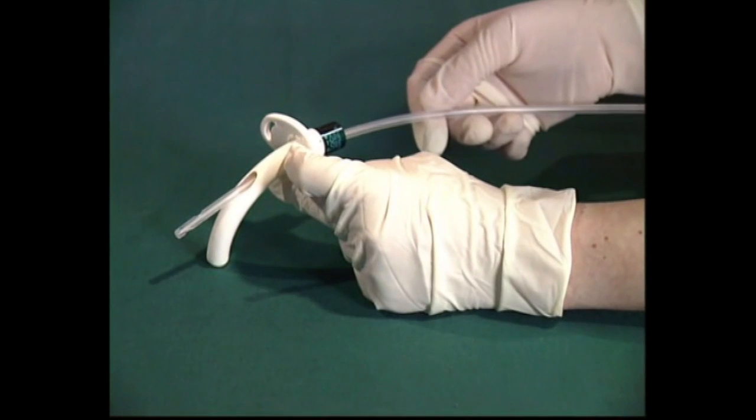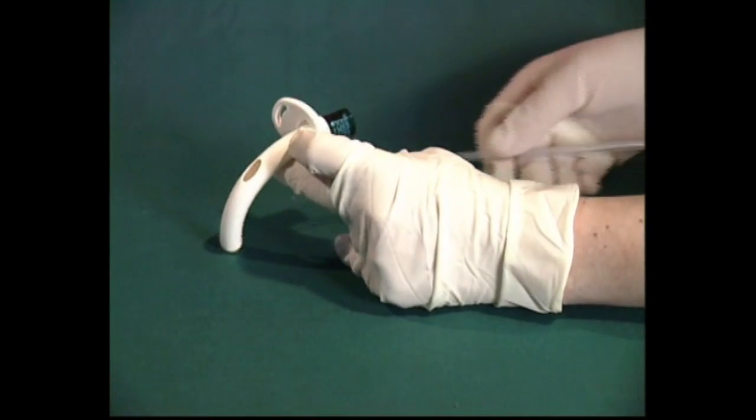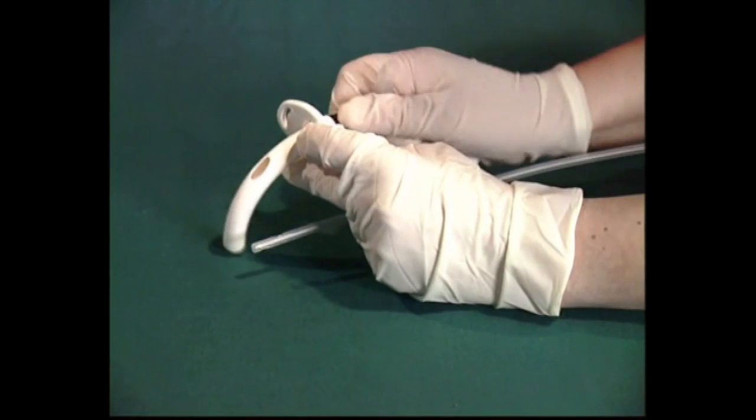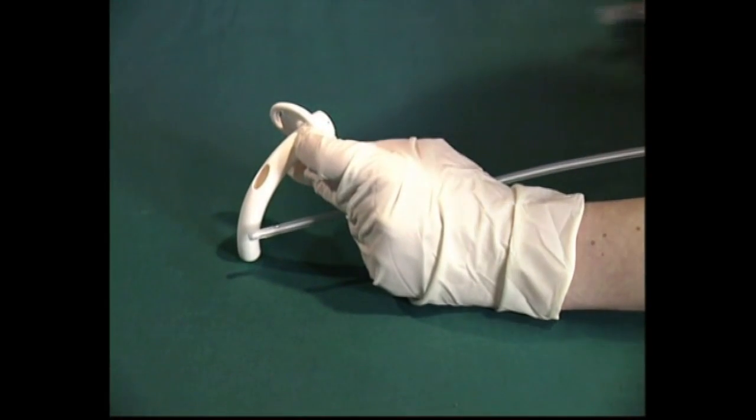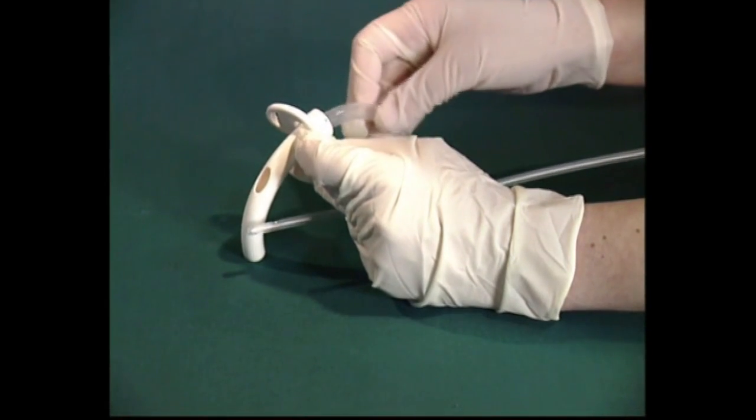Always check what type of tube your patient has in situ and if it's a single fenestrated tube then the non-fenestrated inner cannula should be reinserted prior to endotracheal suctioning.